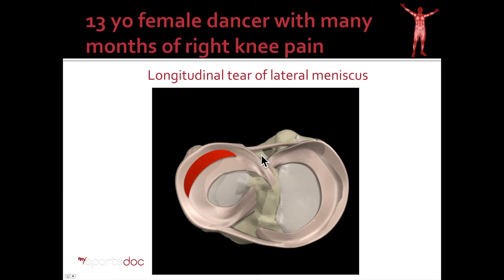What you'll see in this video is an arthroscopic all-inside repair where the camera will come in from one side. We'll then insert instrumentation from another and place a number of stitches in the meniscus to hold it in place.